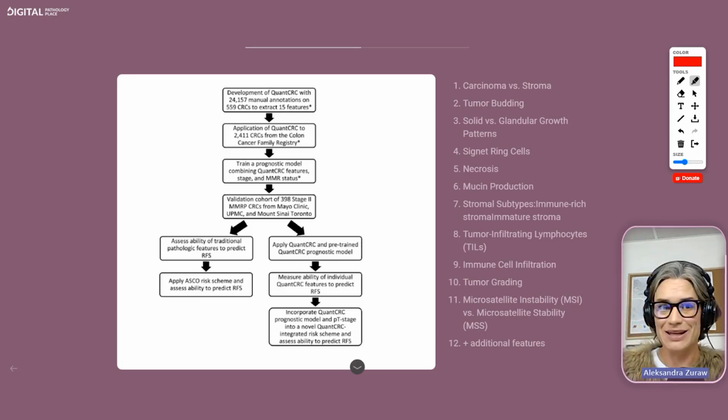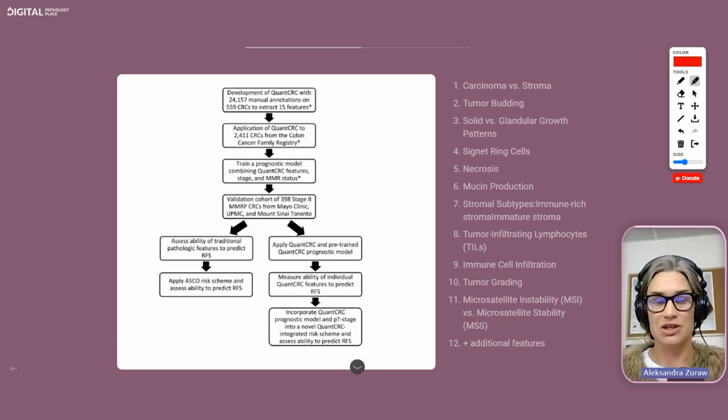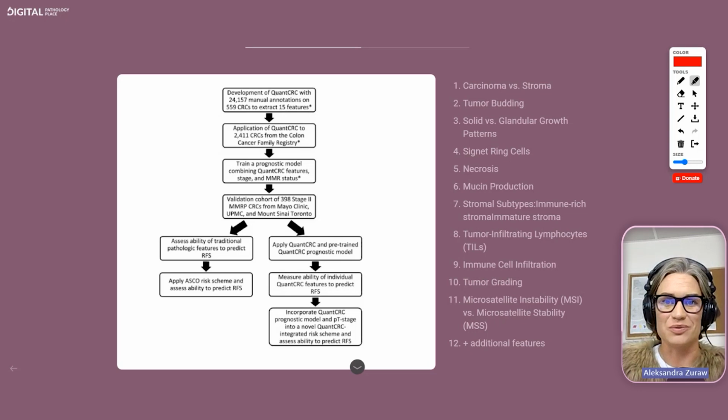And the next level is not really giving specific examples, but like what we had with the molecular data. You just say, this image has this molecular status. Go and figure out where this mutation can come from. I don't have this example in my presentation, but this was applied in the clinic as well in Israel. I was super excited about this publication. Later at the end, when I finish, I'm going to show you which one that was when I find it.